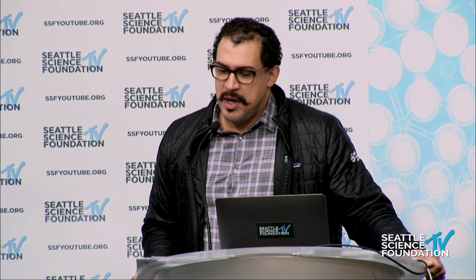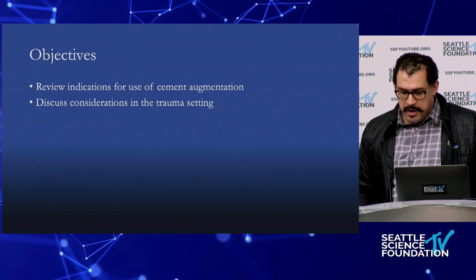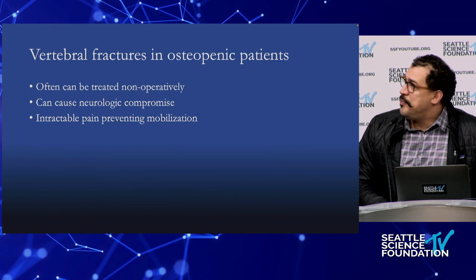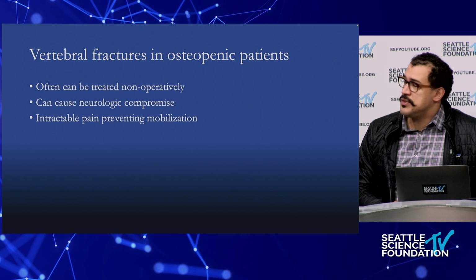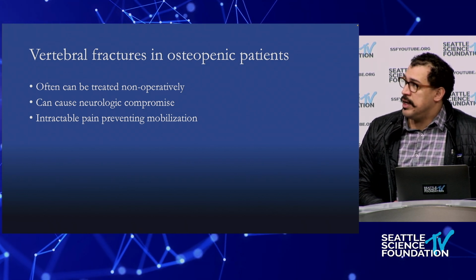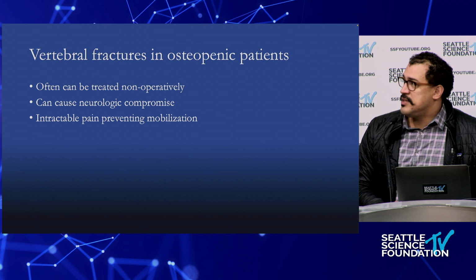Just wanted to go through some of the things that I think of in terms of when we use cement, and some of the techniques as well that can minimize some of the negative effects. Obviously, as we talked about, I won't go over this at length, but increasingly osteopenic patients are having fractures, whether that be high energy trauma or low energy trauma.